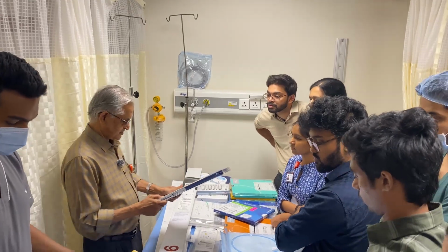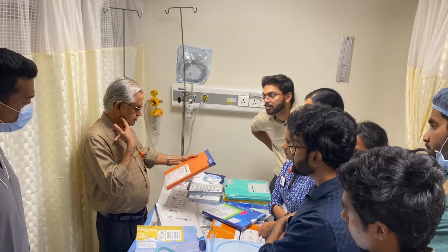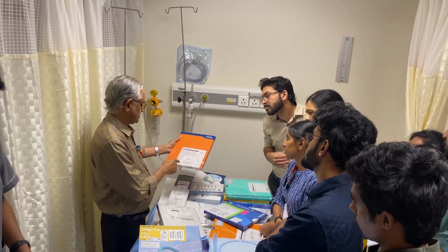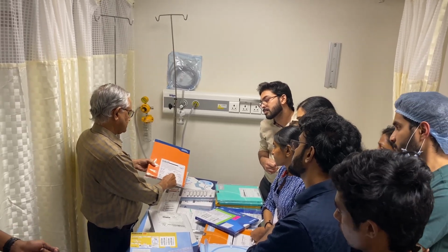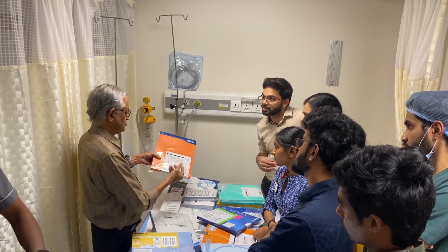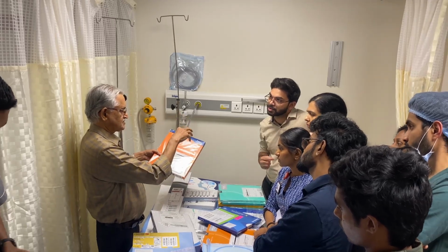This is the stent which is usually deployed. In carotid angioplasty also, you keep the larger catheter or the guiding catheter below, and then you have a protection device. When you are doing the angioplasty, the plaques can break, so they should not go beyond. So this protection device will be put beyond the site of angioplasty.